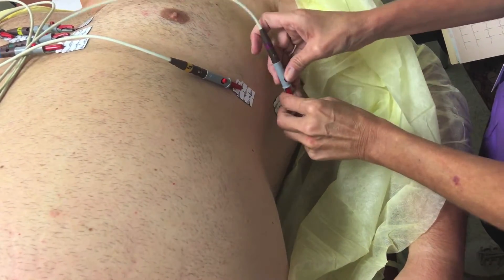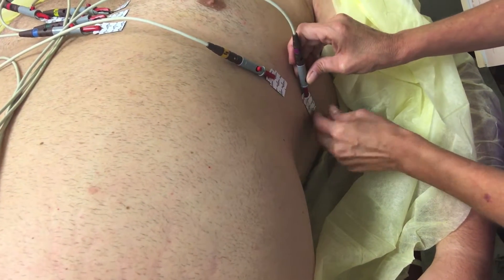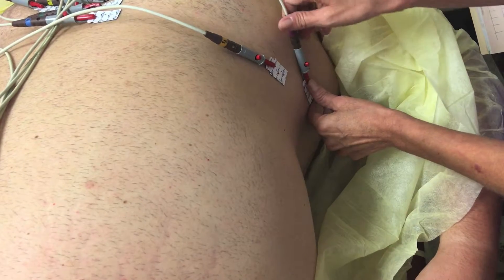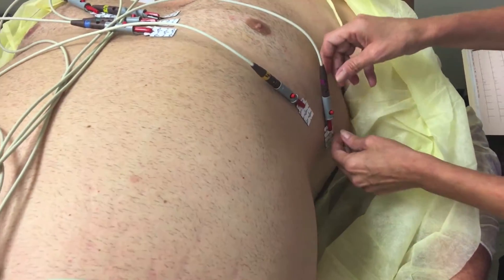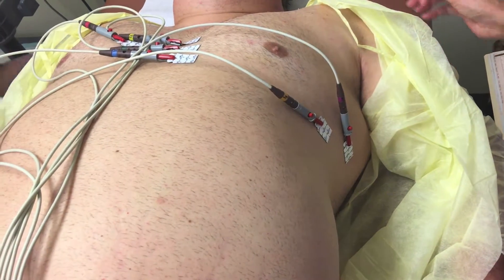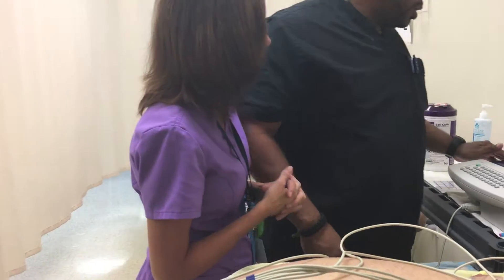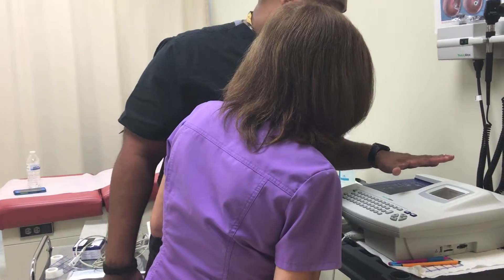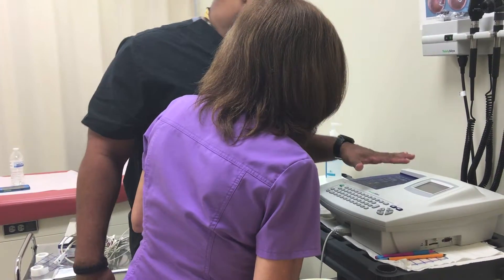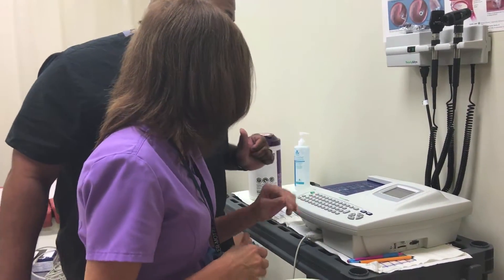Is there any reason why you wouldn't be able to give a person an EKG? If they have a pacemaker, you don't want to do this. Ms. Matthews, you don't have a pacemaker, do you? No, I don't. Now, we have all the leads connected. The machine will tell you if all your connections are good or if any need to be checked. Now we can start our EKG.